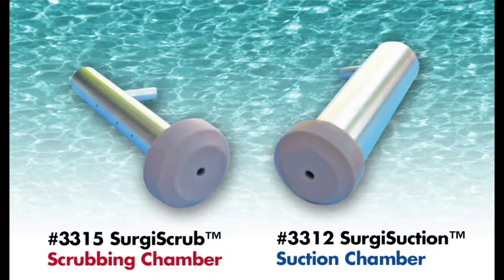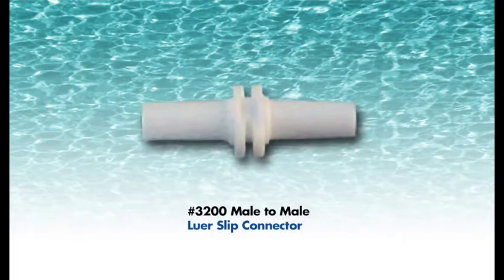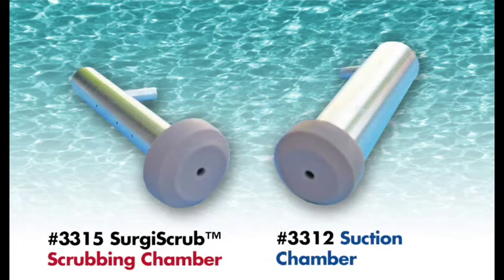Two: the No. 3312 Surgi Suction Chamber applies maximum suction to the shaft of tubular instruments. The No. 3200 male-to-male lure slip connector is used to attach the control box and shaft of the DaVinci robotic instrument to the No. 3312 Surgi Suction Chamber, which was designed to apply a maximum amount of suction to clean the interior shaft of robotic and non-robotic tubular surgical instruments.